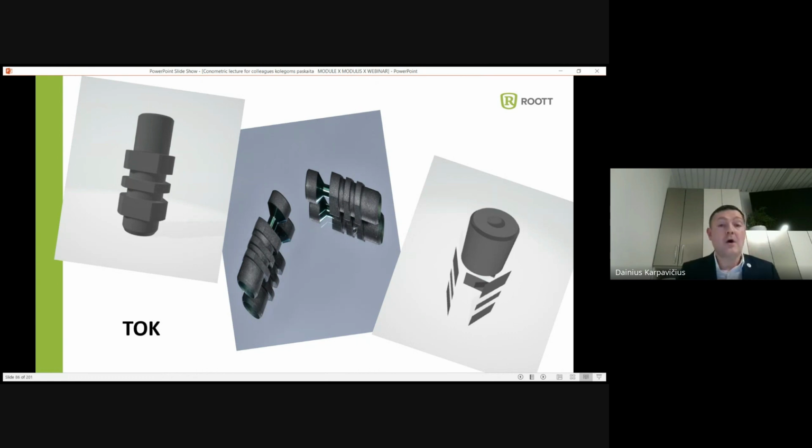If it is on tooth 4, it goes to the lab and comes back to the implant at position 4. The same for 5 or 6. So you are giving the final coordinates of the Conometric cap.